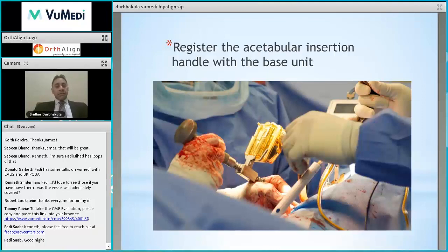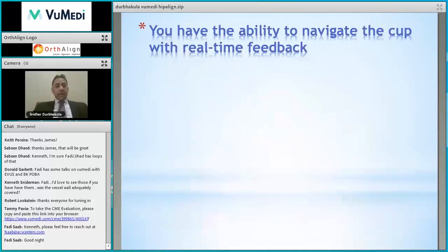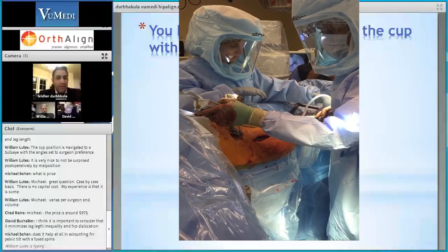And the point of cup insertion is you have a safe zone that you want to put it in, and you want to put it in the optimal cup placement and fixation point within the safe zone. So I think it's important to have the freedom of being able to adjust the cup based on the individualities of each particular case. And you're getting real-time navigation.